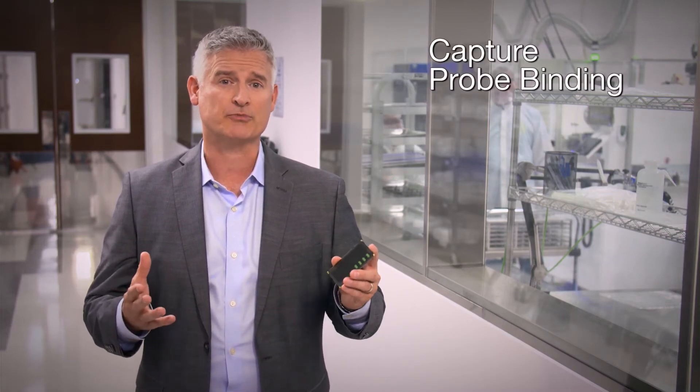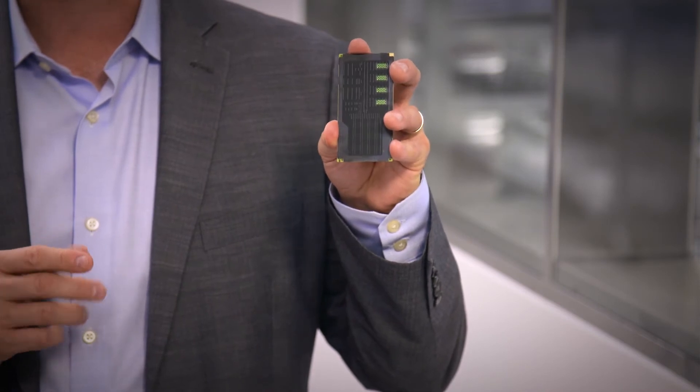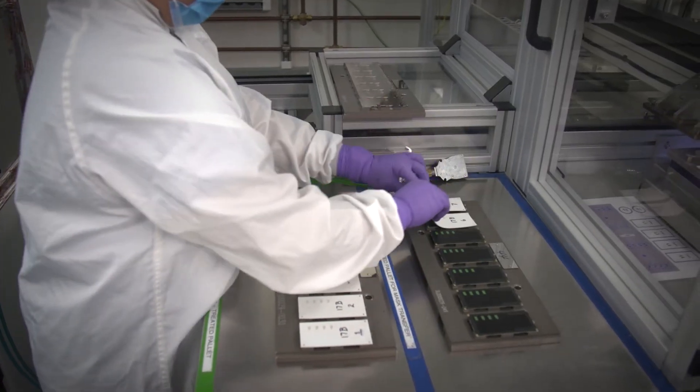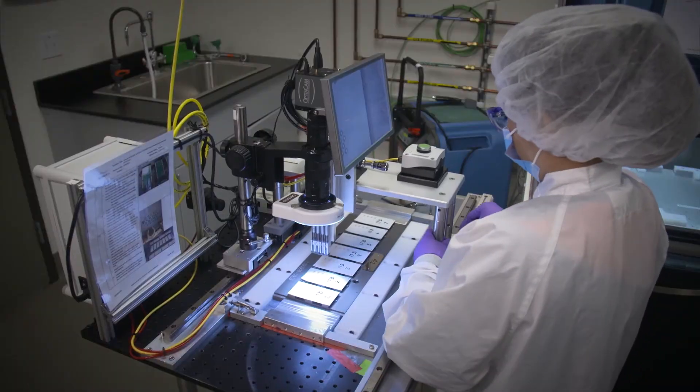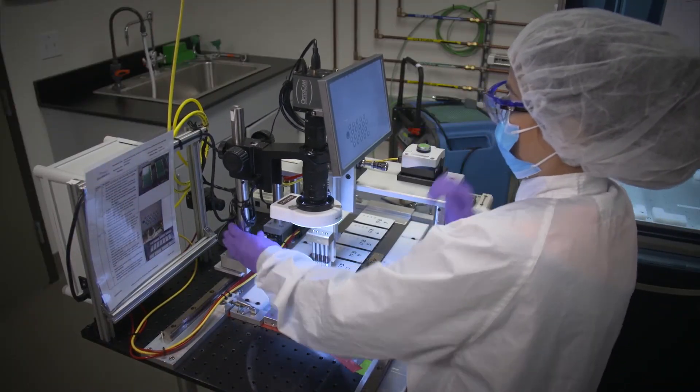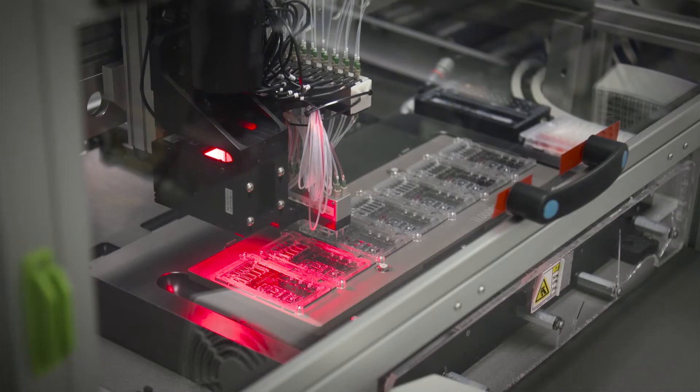In this part of our manufacturing process, we enable eSensor detection by binding capture probes to specific electrodes on the printed circuit boards. Here you see the PCBs being treated by specialized equipment as part of that process.